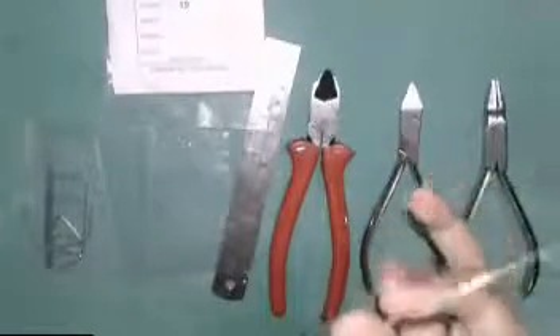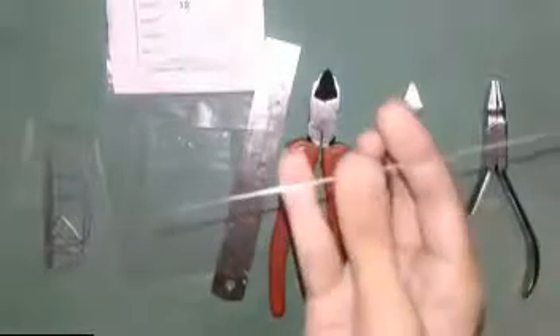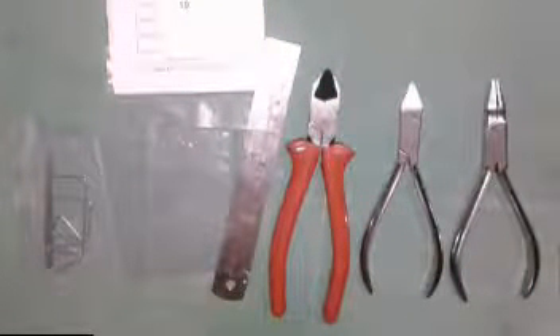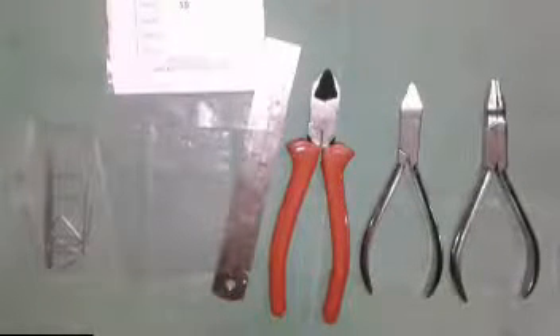We want to straighten the wire. I will show in another video how to make a straight wire and the principles of wire bending. Right now I am just showing the instruments which are required in the orthodontic laboratory work.